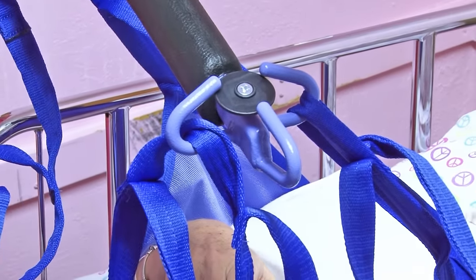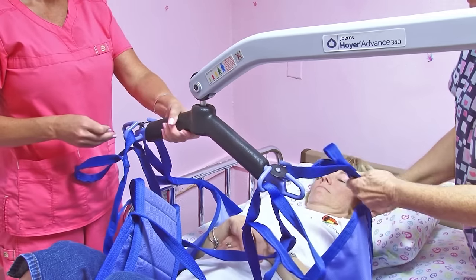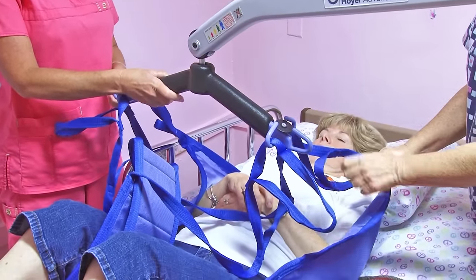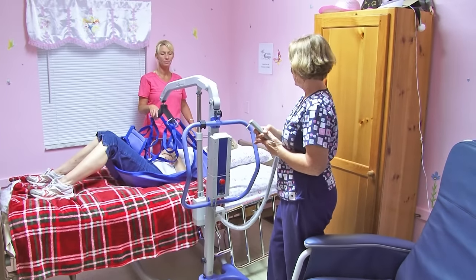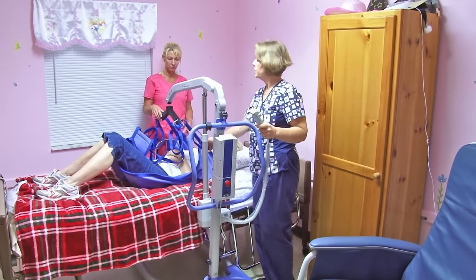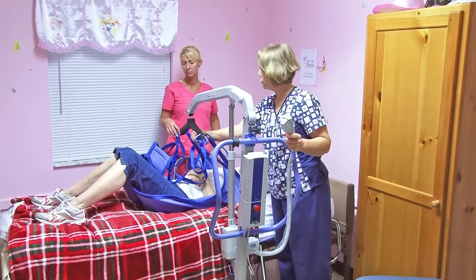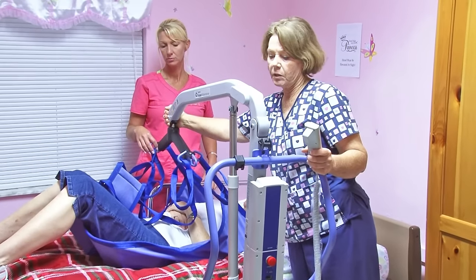Now she's in the sling. You might want to look and see how much space there is between the person and where you're going to be lifting them. If you have to adjust it to a lower loop, just stop and adjust. Now we're going to raise the resident, and we're both going to be watching that she's supported. As she comes up off the bed, her head will be coming closer to this bar. It is cushioned, but the upper portion is not, so we must be very careful about that.